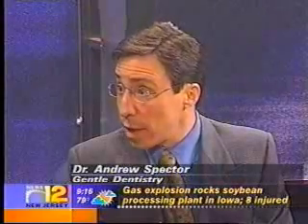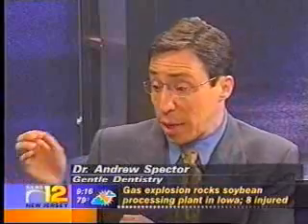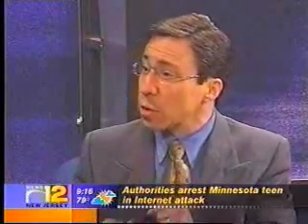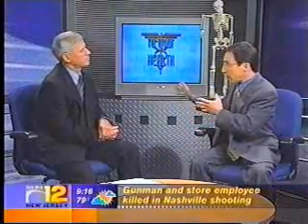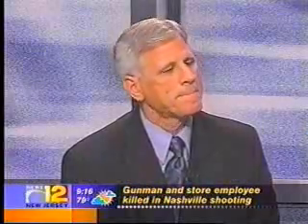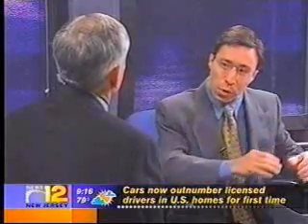Now, two things this brings into play. Number one, how long will it last? Is it as good as any of the others? Absolutely as strong or stronger than what we've had in the past. But again, because this is a factory-made piece of porcelain, it's not made with powder and liquid from a laboratory or melted in the laboratory. It is a consistent material every time I use it. There's no guess factors. Even though you might have a good lab, sometimes something might come back not as dense as it might have been because something might have happened and the doctor wouldn't know it. Right. So you control those factors where I know every time what I'm putting in someone's mouth.